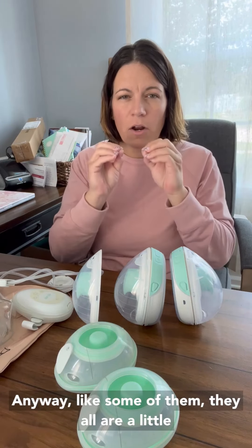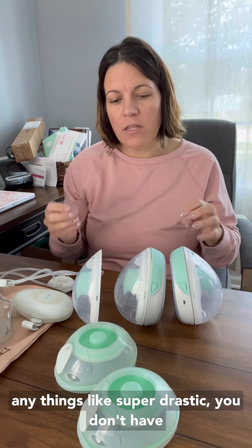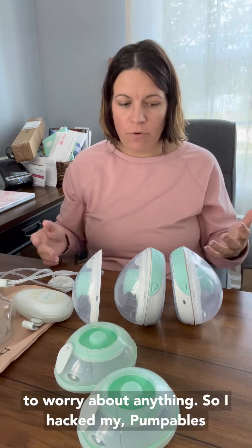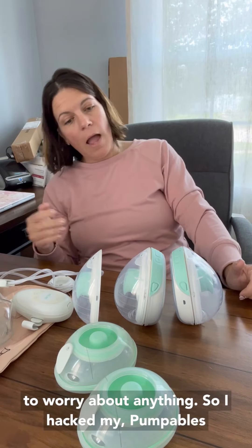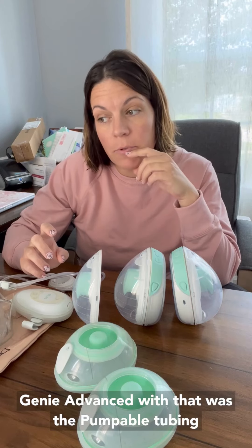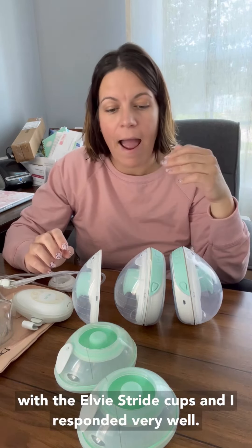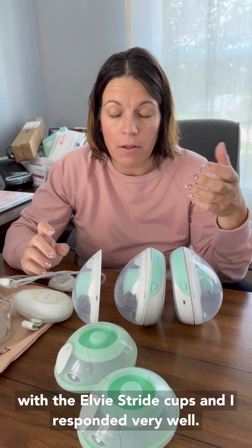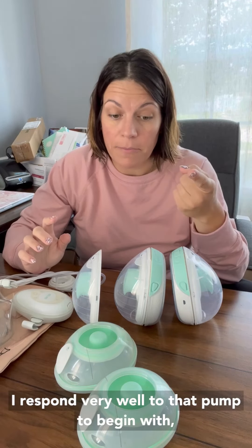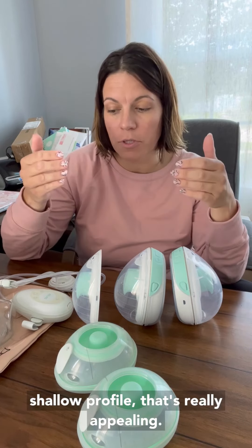They're all a little different from each other, but ultimately they're all about the same size. So unless anything is super drastic, you don't have to worry about anything. I hacked my Pumpables Genie Advance — that was the Pumpables tubing — with the Elvie Stride cups, and I responded very well to that pump to begin with. Adding in these cups, you've got that shallow profile that's really appealing.